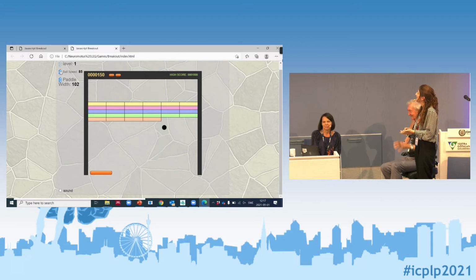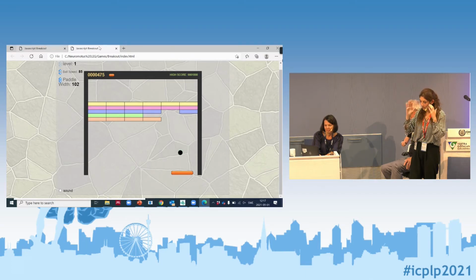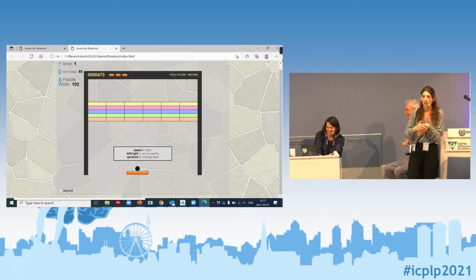Good. Yes. Excellent. So the idea is that here in the game, you can keep challenging the participant to try to reach different stages and promote different movements. So for example, when you are with a patient, you can say, hey, let's try to kill all the pink, or you can put different goals to keep them moving through. It also happens that sometimes they get distracted and it's quite hard to manage.